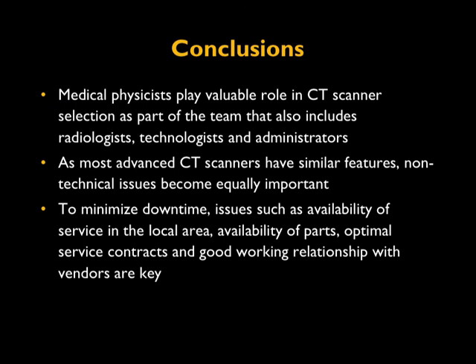Issues such as availability of service in the local area become very critical, as do availability of parts, optimal service contracts, and a good working relationship with vendors. These trump even the type of scanner, because this becomes an important process in the workflow of the whole scanner selection.